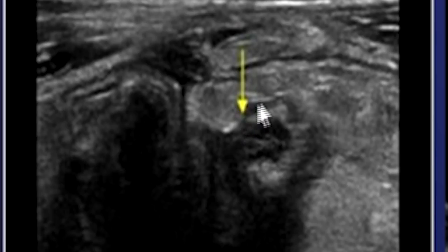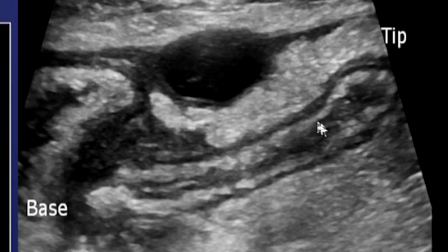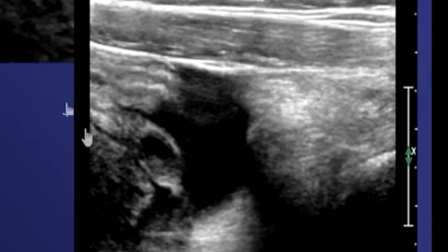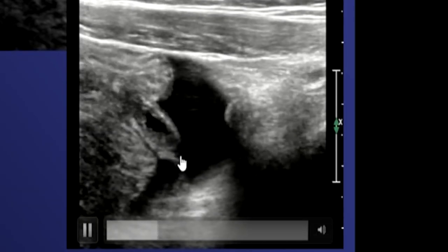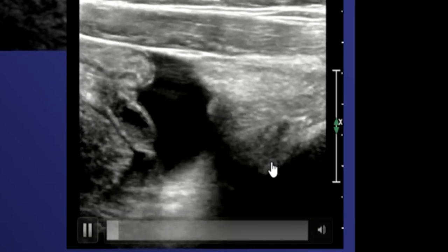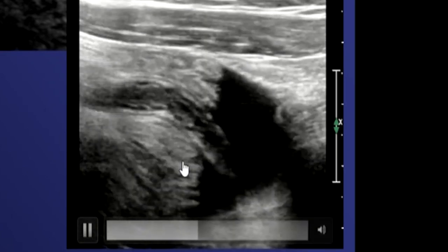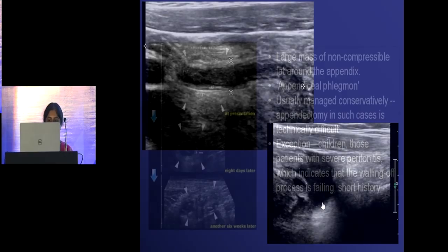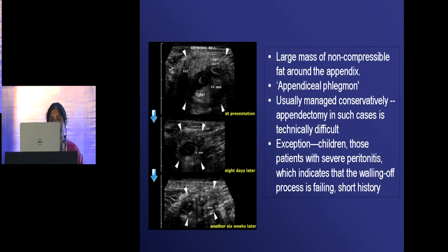Perforation can be diagnosed by loculated pericecal fluid, phlegmon, prominent pericecal fat, and circumferential loss of the submucosal layer. In the transverse view this layer is seen well, but where there is perforation it disappears. You look at the blind-ending surface and see the discontinuity of the mucosal lining — that is how you suspect perforation.